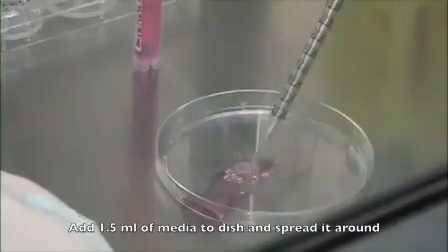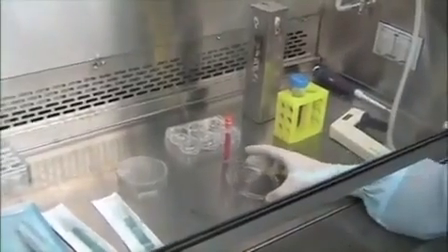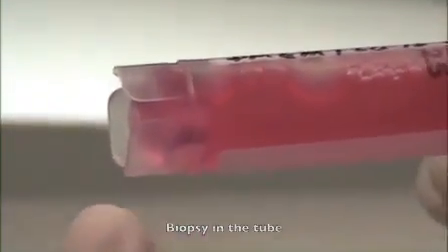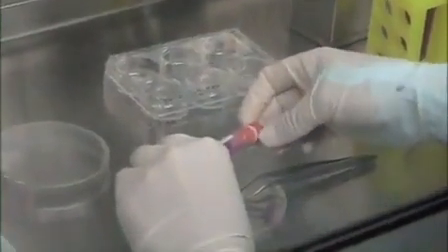Spread the media out from the center. Here you can see the skin biopsy. The next step is to transfer the biopsy from the tube into the center of the cutting dish. Using sterile forceps, place a skin biopsy piece at the center.